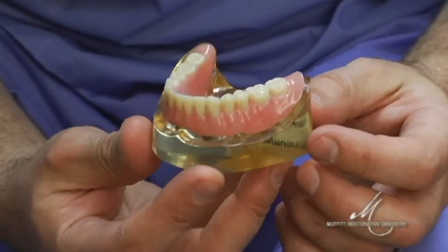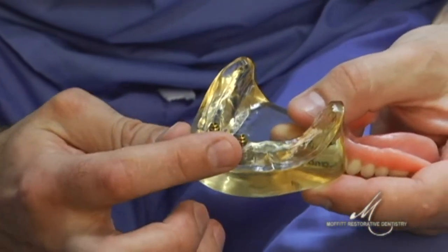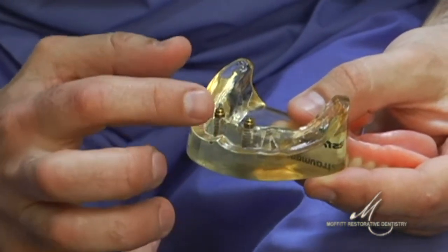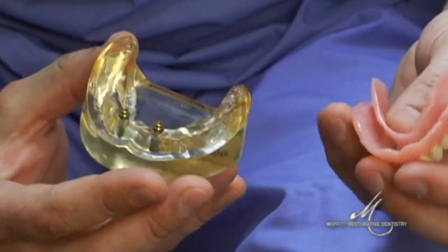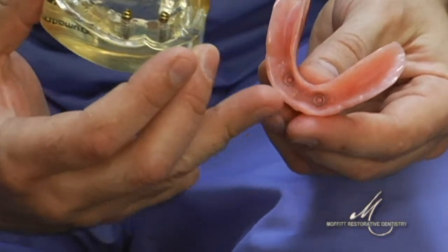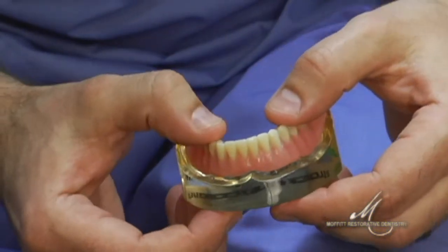This is a model of an implant-supported denture, where minimally there are two dental implants towards the front of the mouth. And as you can see in this clear model, these are abutments that are tightened into the dental implants. A denture would have a housing for these retentive elements, as we call them, and in this case, the denture then snaps in place.